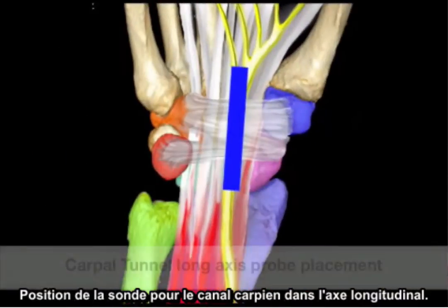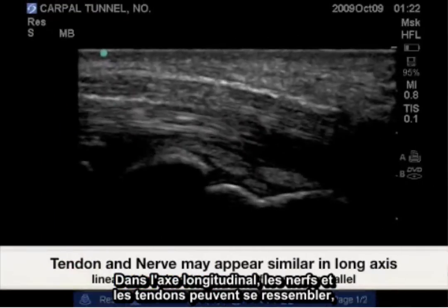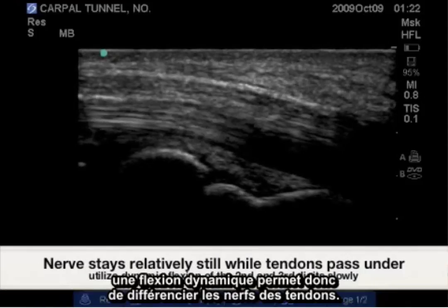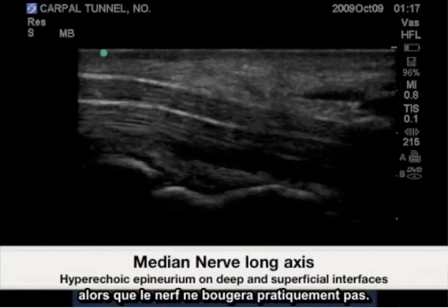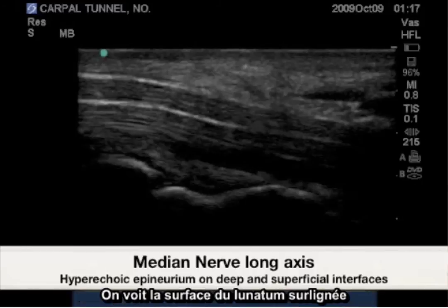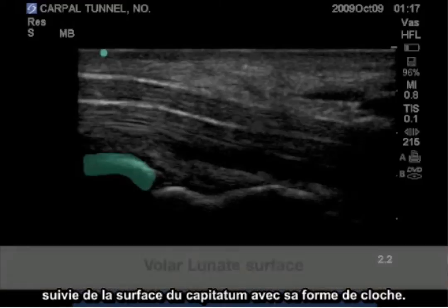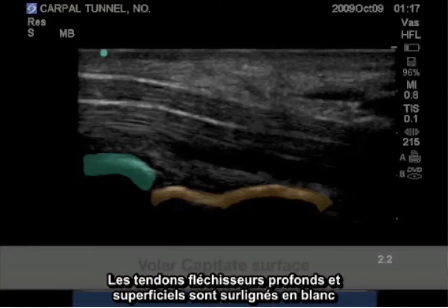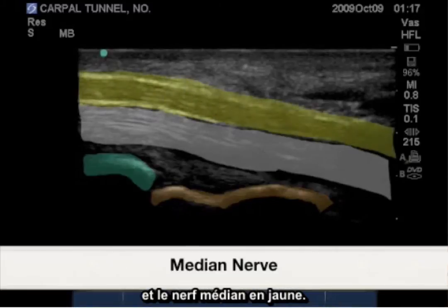Probe position long axis carpal tunnel. In long axis, nerves and tendons can look similar. So dynamic flexion will determine nerve from tendon, as the tendon will slide beneath the nerve while the nerve stays in a relatively stationary position. Highlighted is the volar lunate surface, followed by the volar capitate surface, which is bell-shaped. The deep and superficial flexor tendons are highlighted in white and yellow representing the median nerve.